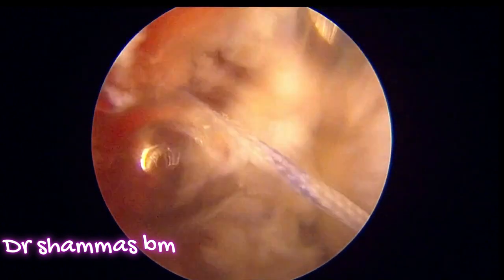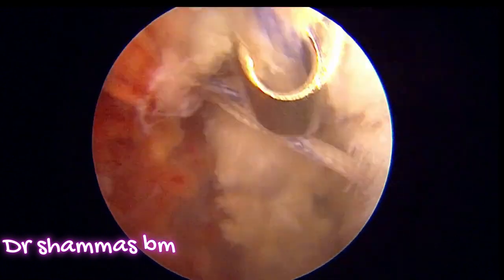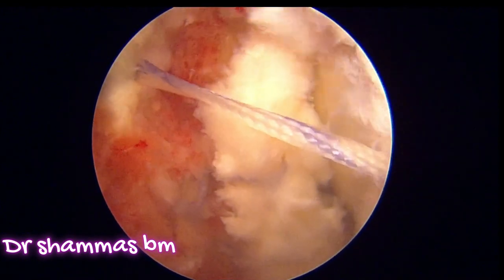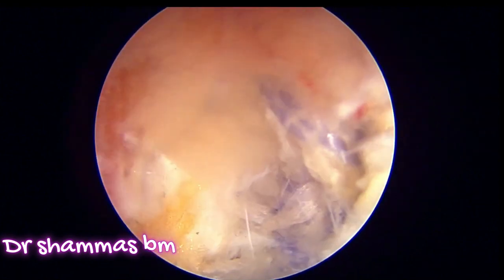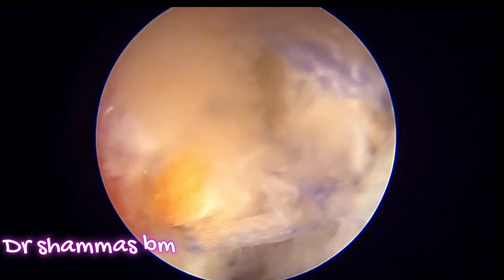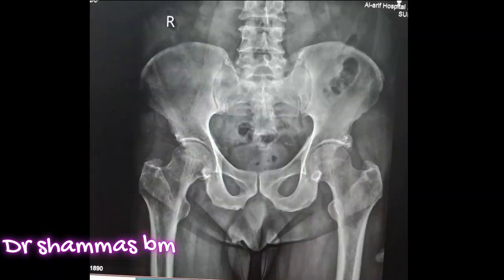The rent in the capsule will be closed completely. You can see the knots coming in with the knot pusher — the capsule is closing — and this suturing is repeated two or three times. We reduce the traction completely on the affected limb and then put the knots. With this, we come to the end of the procedure. This is the post-operative x-ray — you can see that the pincer lesion has been completely removed from the right side. Goodbye and take care.